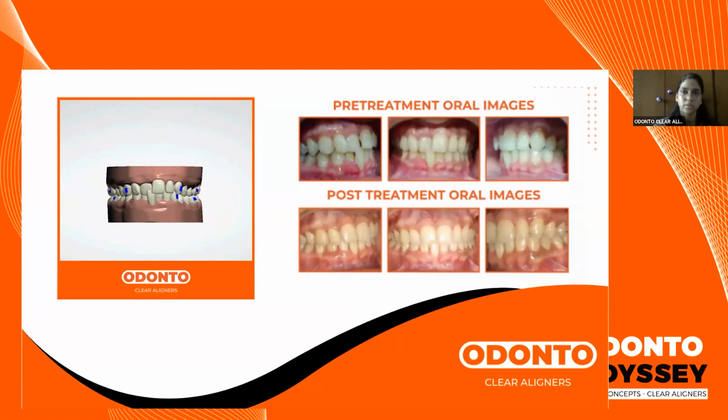We will require some amount of proximal reduction because we first need to make space to correct this crowding. And then we proceed with bringing the teeth in line and correcting the crossbite. This is again in a mild category.